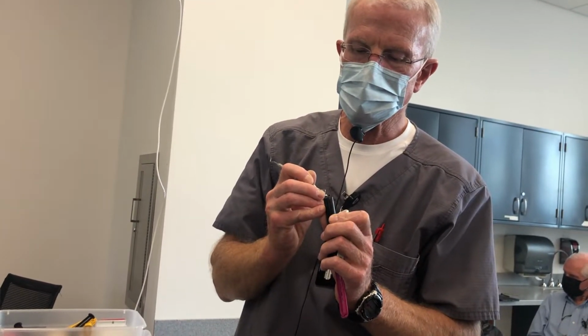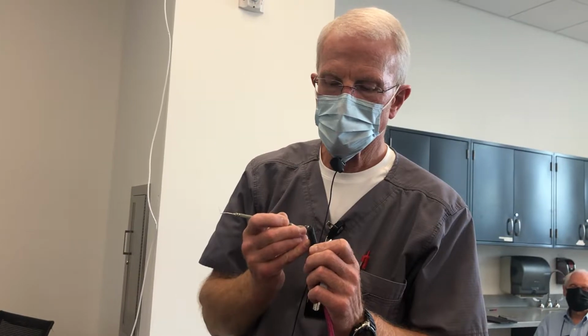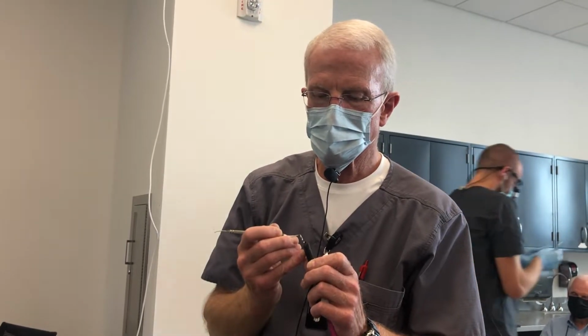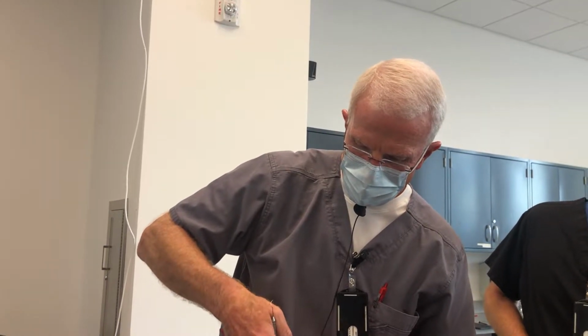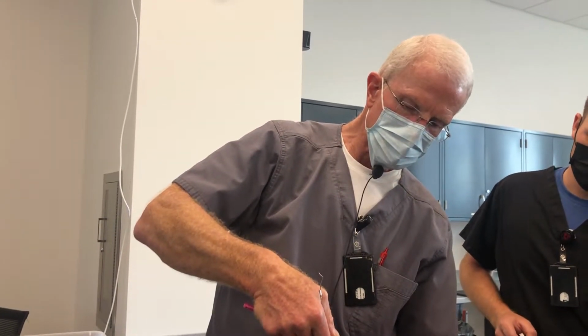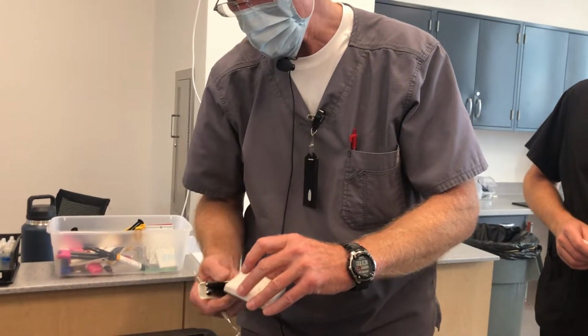Usually you'll get just a nice little dispense of both of these. Somebody have something I can wipe this with? So let's see if that's going to give us a little. Okay, we're going to force this one. There, it's coming. See, this is drying out, getting too old. That's too viscous. So let's try this. That's better. There we go. Now we're starting to get down to some flowing resin.